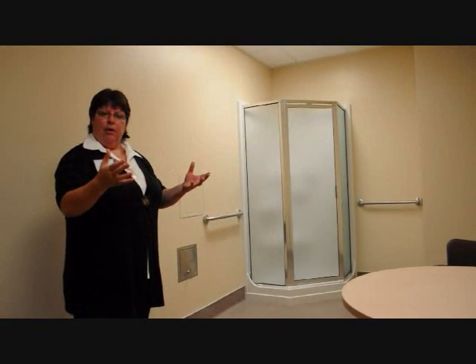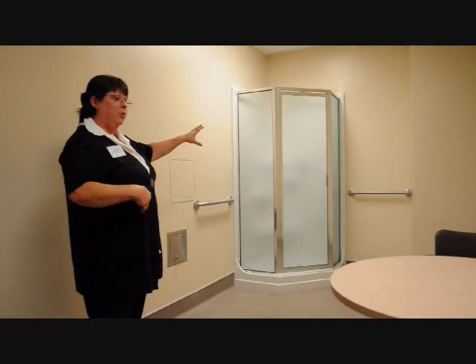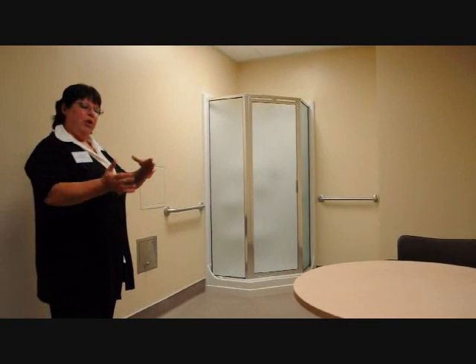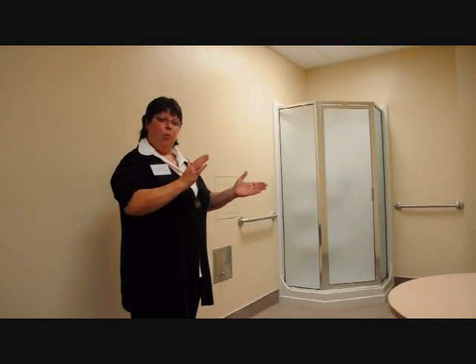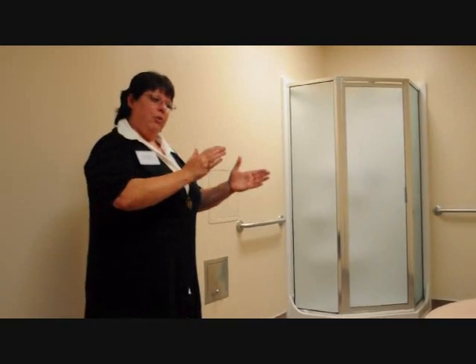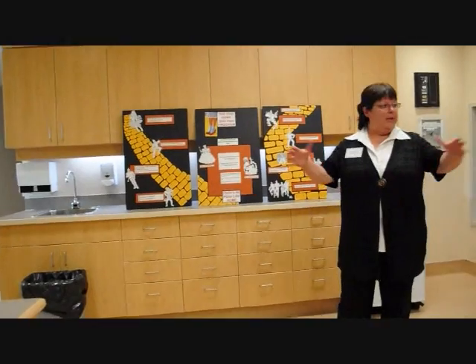We do need to teach them good aseptic technique, hand washing, connections. They have a catheter, so they have an exit site. So we have a shower here, so we need to teach them how to care for their exit site safely. So we try to mimic what they're going to be doing at home by having the shower, by getting them to do actual shower demonstration, re-demonstration, and the learning is done one-on-one, and we try to have the learning done to meet their needs, how they learn, if they're more visual, more hands-on learners, so it is a one-to-one process.